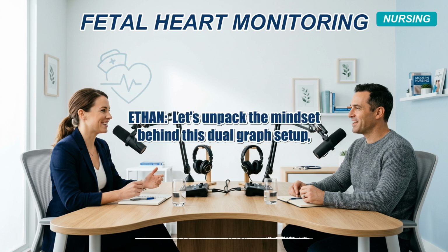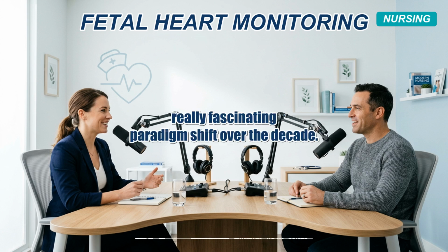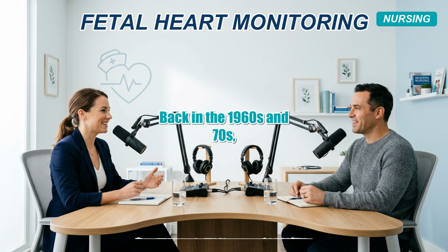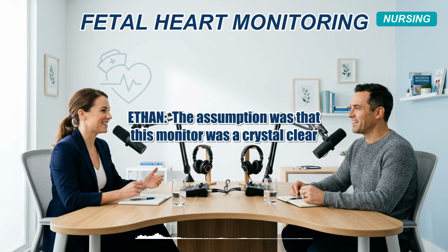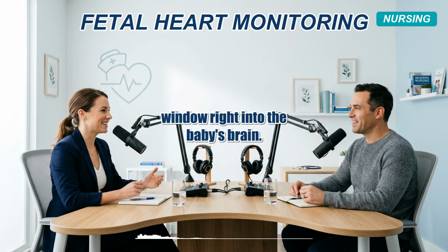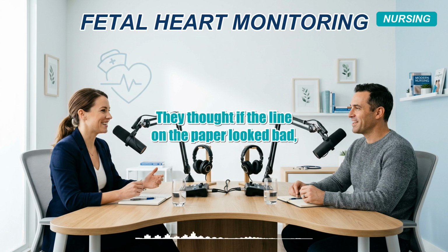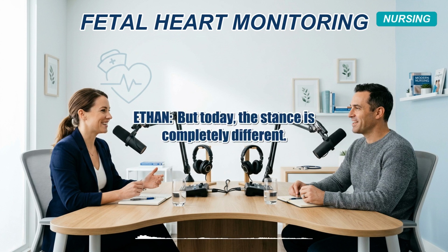Let's unpack the mindset behind this dual graph setup, because the way the medical community views this tool has undergone a massive, really fascinating paradigm shift over the decades. It really has. Back in the 1960s and 70s, when this technology first rolled out, doctors treated it as a new diagnostic tool. The assumption was that this monitor was a crystal clear window right into the baby's brain. The belief was entirely straightforward. They thought if the line on the paper looked bad, the baby was in immediate, irreversible danger and required surgical intervention. But today, the stance is completely different.